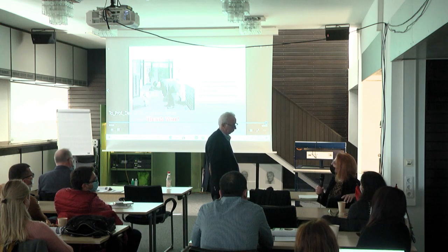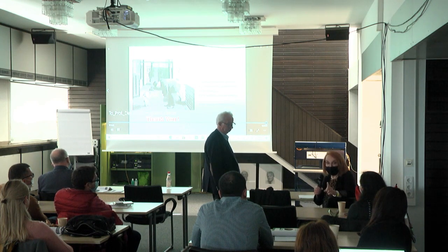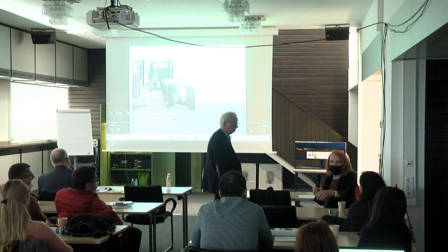It's just different. You wouldn't think of doing it. If you were to say to your gastroenterology colleagues that you're going to do an ultrasound to stage a gastric cancer, they wouldn't buy it easily either. So it's just really kind of an experience. But Pintong and his colleagues do very good work.